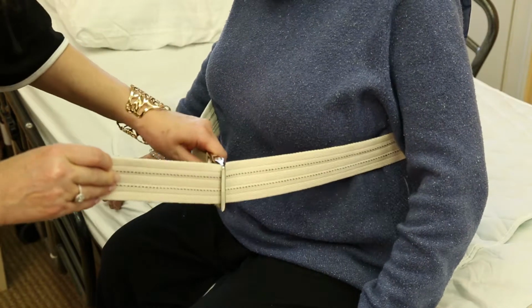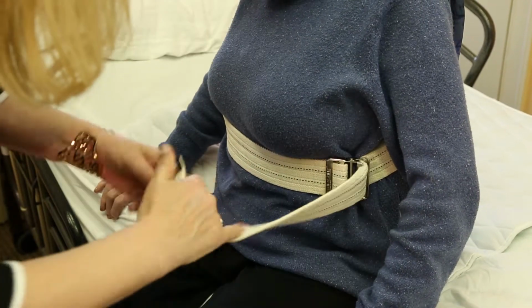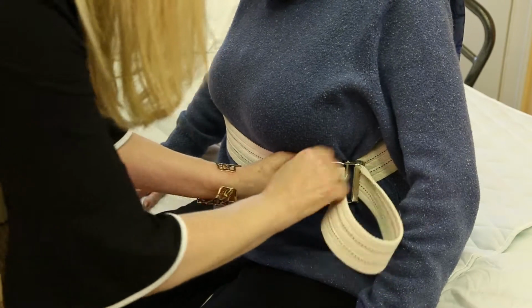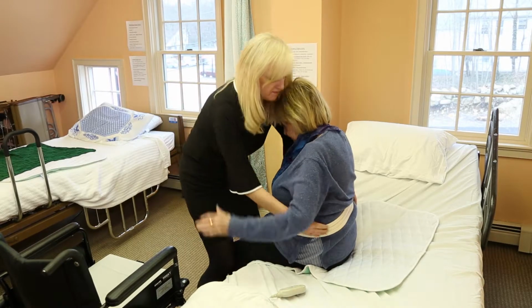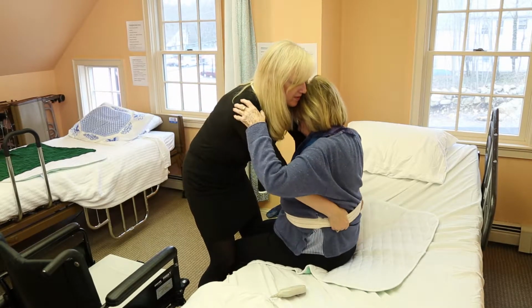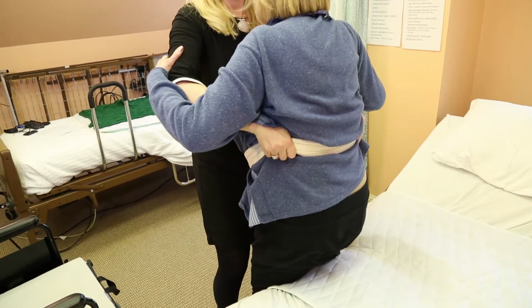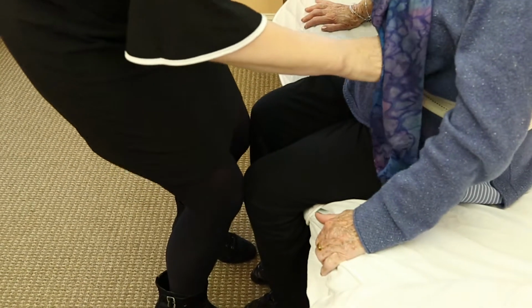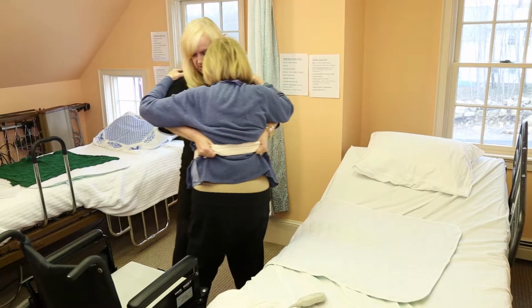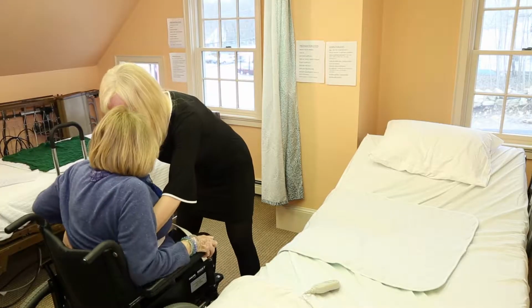When putting the gait belt on, make sure that you can put 3 fingers between the gait belt and the patient, so it's not too tight for them. Grab the gait belt by both sides, rock the patient 3 times, bring the patient to a standing position. Please make sure that your knees and the patient's knees are locked together. With a dancing motion, transfer the patient sideways from the bed to the wheelchair, holding onto the gait belt.